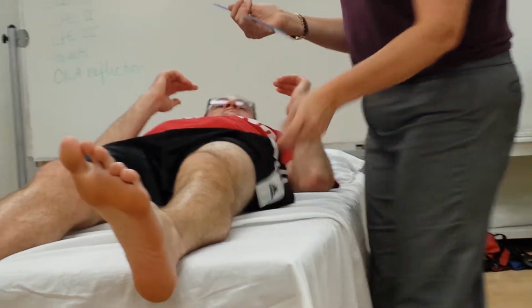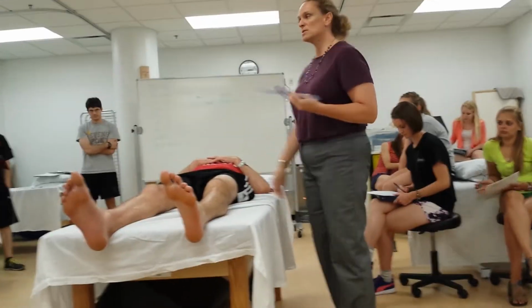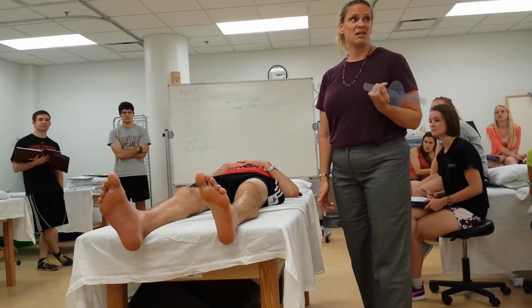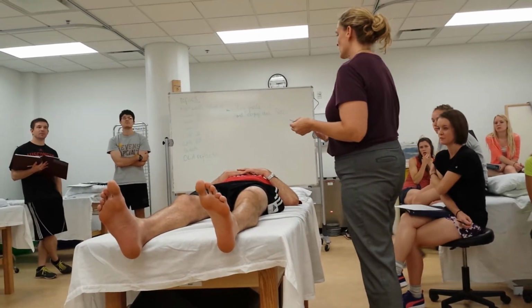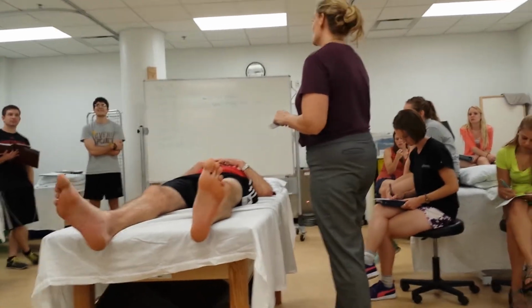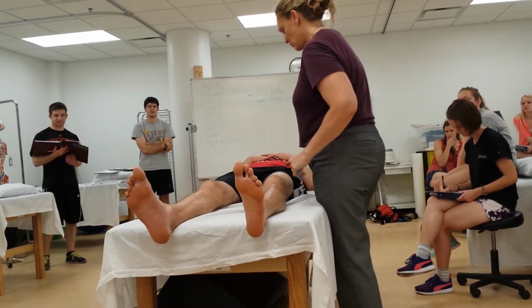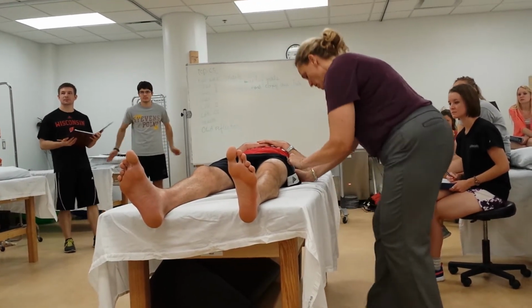I realized we didn't talk about landmarks. So, stationary arm, if we're measuring hip motion, what's it going to be? Don't need to look at the slide. What is it? Trunk. Mid-axillary line, right? What are we going to do with the moving arm? Femur. We're going to bisect the femur. I gave it away and told you the axis was going to be greater trochanter, right? Okay? So, I'm going to find the greater trochanter, which, yeah. If I couldn't find it at Scott, that'd be a problem. Right?